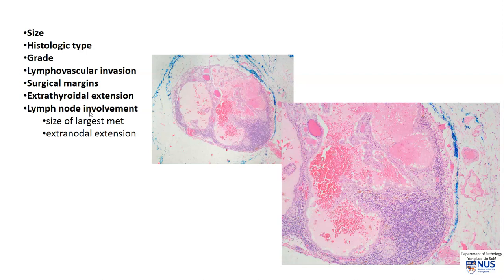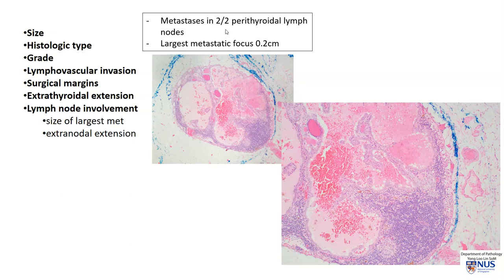The last thing we want to look at is whether or not there is lymph node involvement. This depends on whether the clinician excises additional lymph nodes in the lymph node dissection, or sometimes we can find perithyroidal lymph nodes when we examine the thyroid itself. In this instance, there were actually metastases in two out of two perithyroidal lymph nodes. Here is an example of a lymph node within the perithyroidal fat, and we can see a metastatic deposit measuring 0.2 centimeters. We would measure the largest metastatic focus. The metastasis is cystic, which is very common in metastatic papillary thyroid carcinoma. A higher magnification view shows the papillary structures and the lymph node parenchyma, with no evidence of extra-nodal involvement.